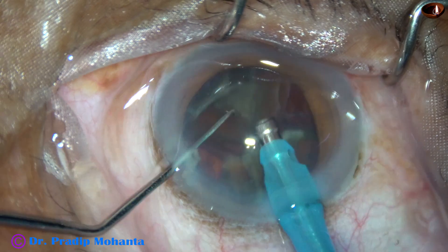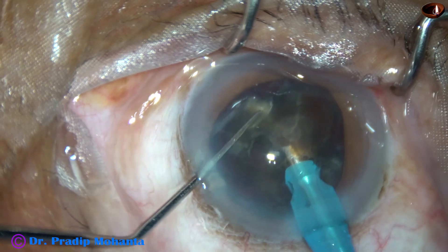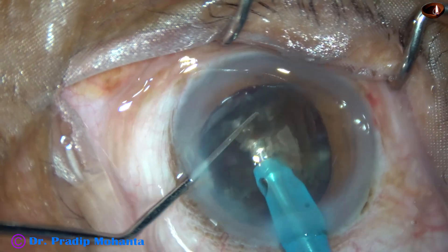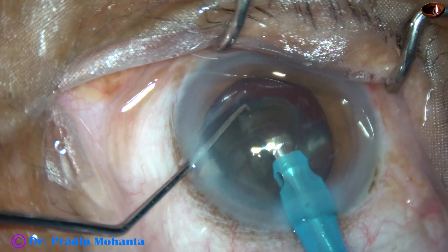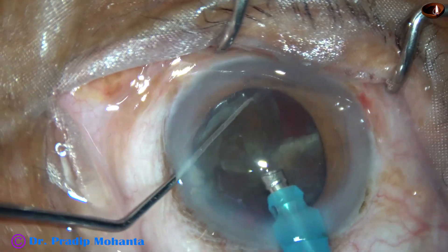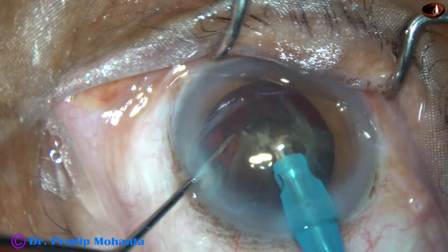But if you have a tendency to come a little upward, please use chondroitin sulfate and sodium hyaluronate. And below this dispersive viscoelastic, use any cohesive viscoelastic or even HPMC.